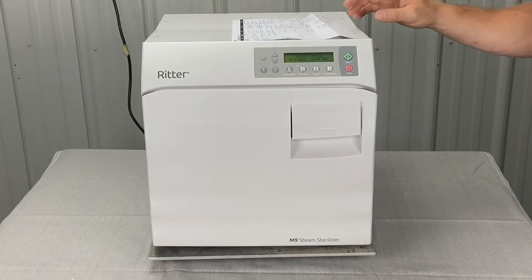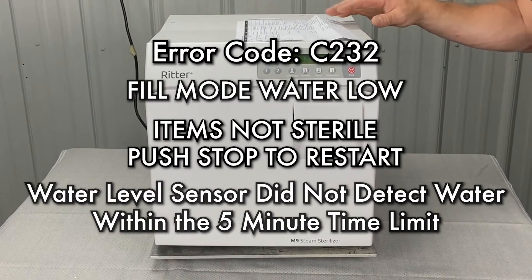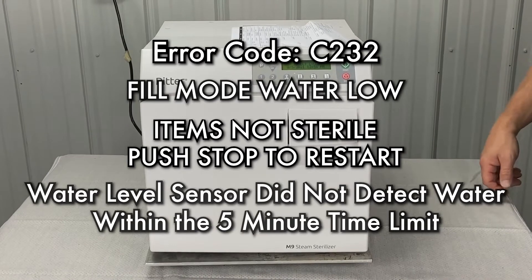We're going to talk about the Charlie 232 error code: fill mode, water low, items not sterile, push stop to restart.